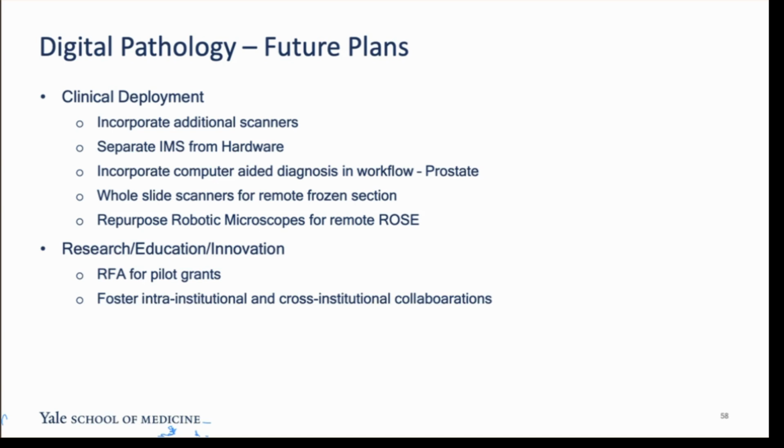We are realistic. I don't think it'll be a huge bolus of money. I think it's more likely to be a 5-year plan that makes us predominantly, if not completely, digital at the end of 5 years. We are quite clear that we need to separate our image management system from our hardware. And truth be told, I think the market is headed that way too.